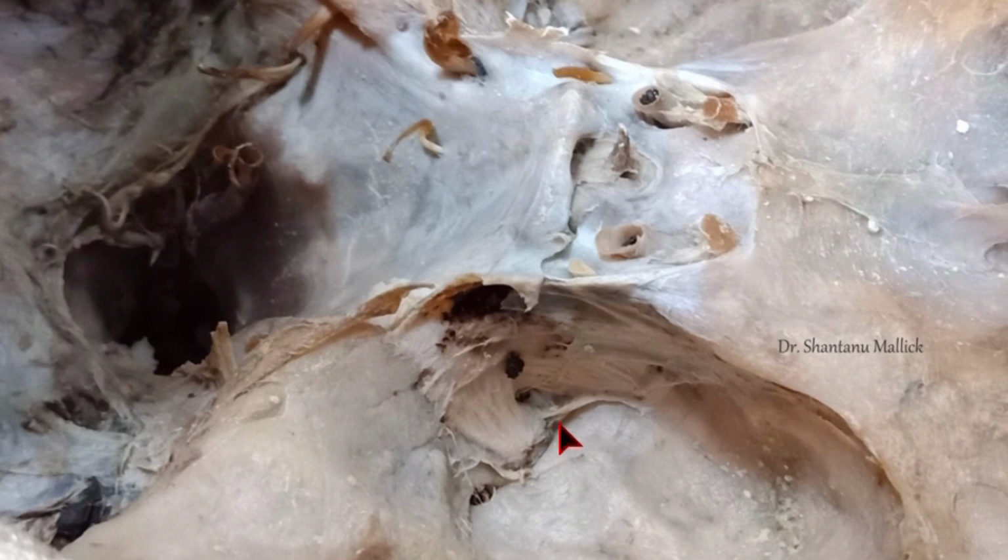If you are planning to go for V1, you have to imagine how much you have to come inside, how much you have to come medial, how much you have to come superior. So accordingly, you will be able to get the stimulation. Then I will show you, I have taken some measurements on 6 skulls so that we can assume how much I have to go inside. So if I am planning for V1 and if I am planning to ablate the ganglion, how much I have to come inside so that I can reach the middle of the Meckel's cave.